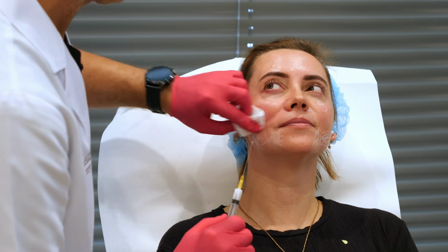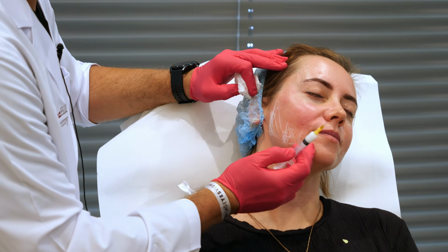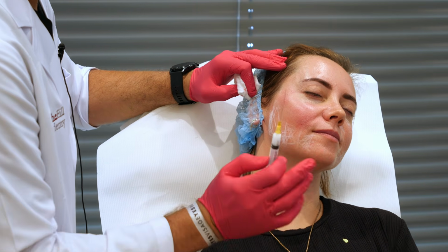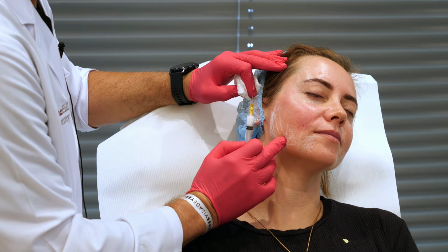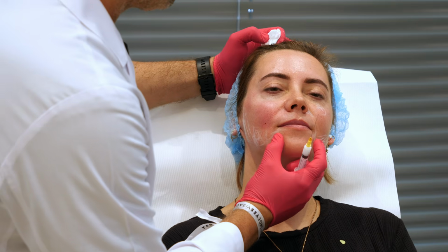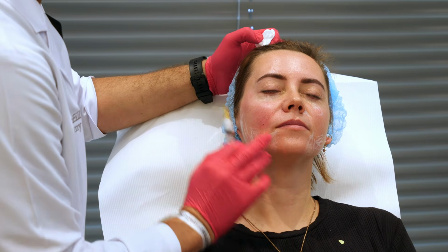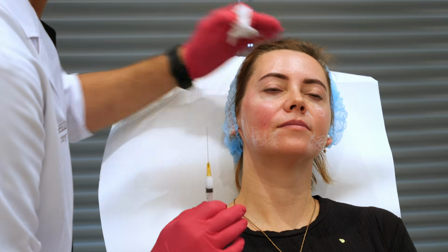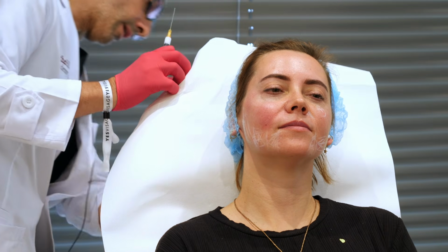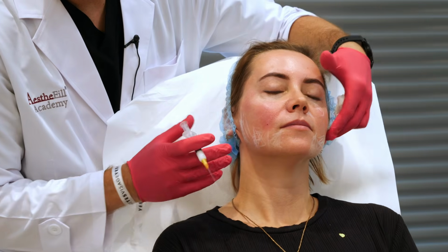From here, we can go to the mentolabial zone, the depression, if you prefer, from here. It's the same, okay? She has a deep one, and I want to put something from here, okay? Here.